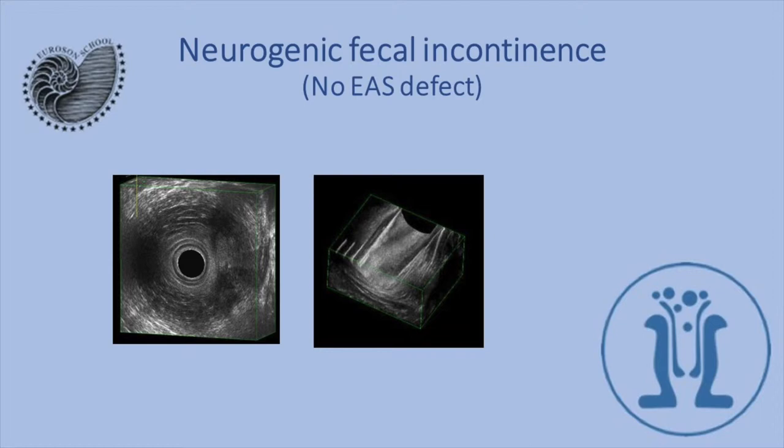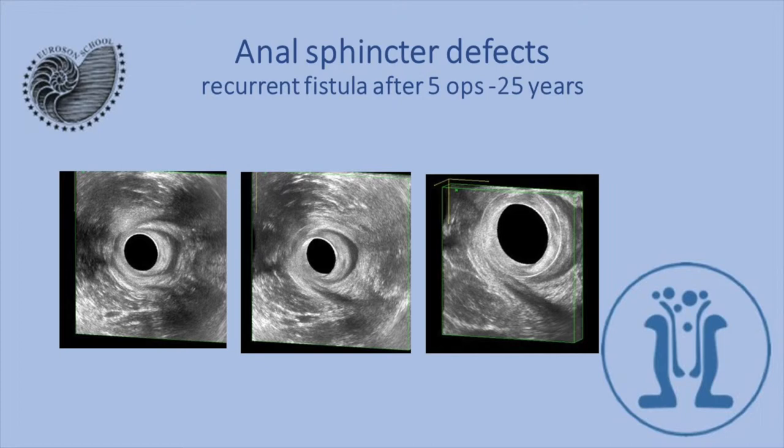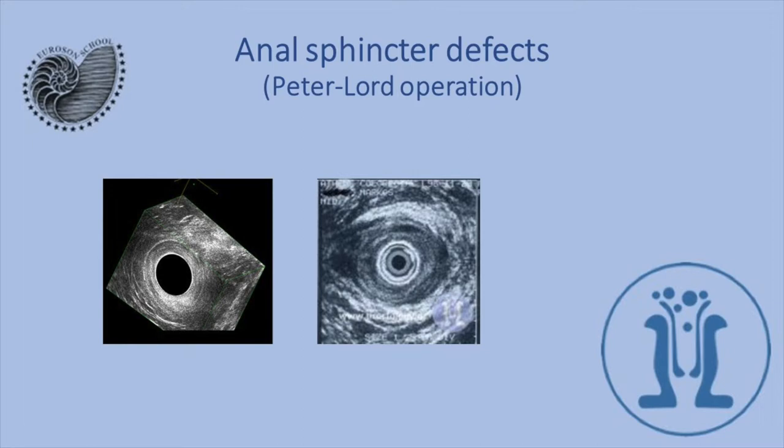Here we see sphincter defects in a 56-year-old man who had multiple operations and a recurrent fistula. He also has this sphincter defect, and the surgical operation should be very cautious because he can be left with fecal incontinence. Here we see anal sphincter defects after Lord's operation — anal dilatation.